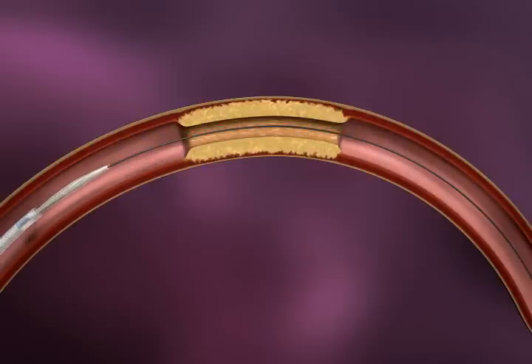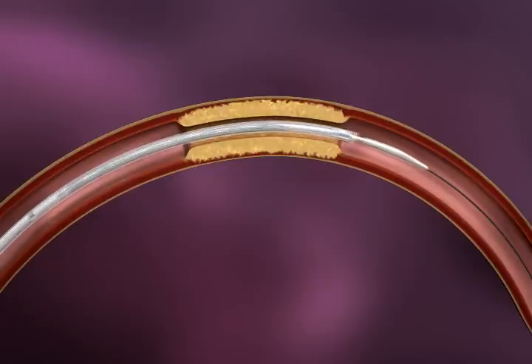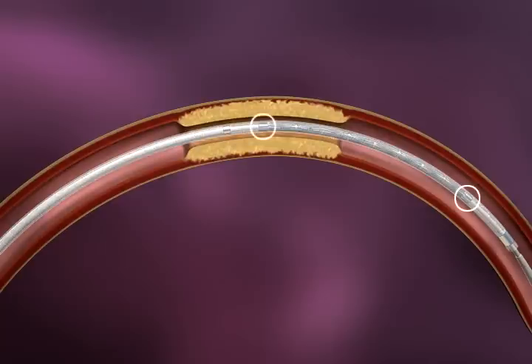Advance the Wingspan Stent System over the exchange length guide wire. Continue to advance the delivery system over the guide wire until the stent is slightly distal to the target lesion. Observe the proximal and distal marker bands indicating stent position.